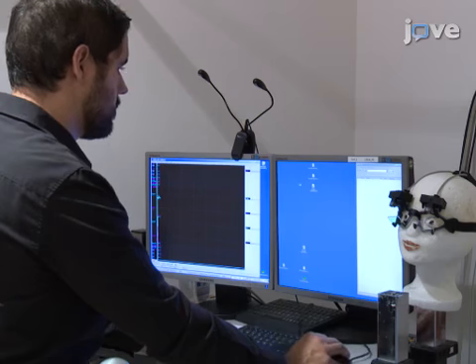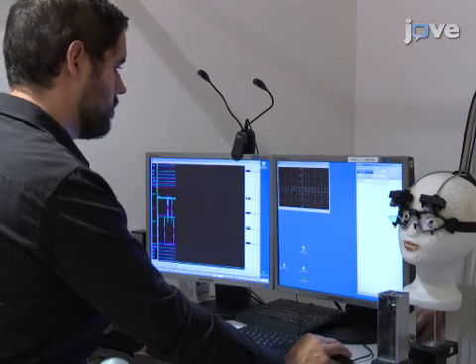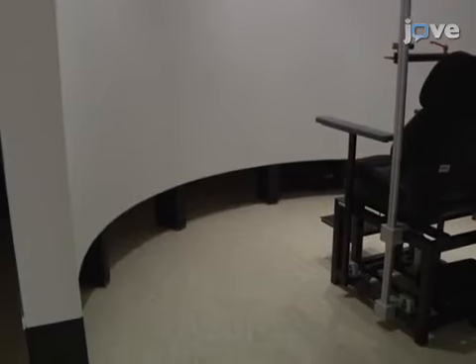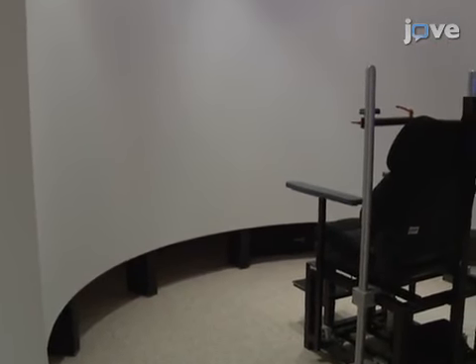Next, set up a standardized oculomotor testing paradigm, such as a series of saccadic tasks, in order to detect deficits in eye movement control. Use software to present these tasks on a hemicylindrical screen via a projector that is mounted above where the participant will sit.